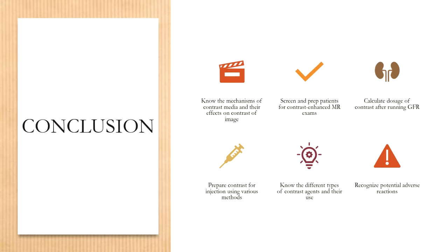to hear the patient as you're injecting them with the contrast, and just to see if anything happens. If they're screaming or moaning in pain and the machine is running and your sound is off, you are not going to catch that. It might be loud for a few seconds, but keep the sound on so you can hear what your patient is doing and feeling. And that way you can catch a reaction in its early stages as opposed to when it's gotten worse.